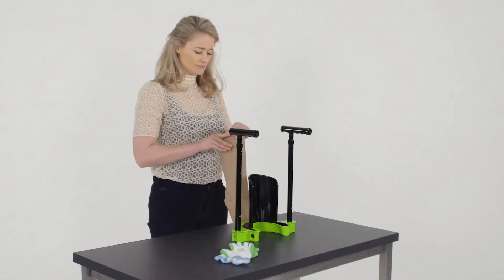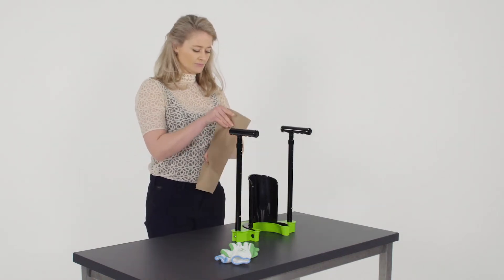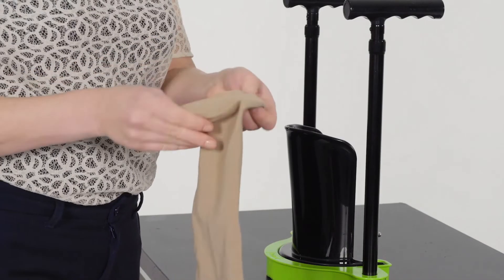Take the stocking with the heel towards you and fold the top of the stocking for a good grip.